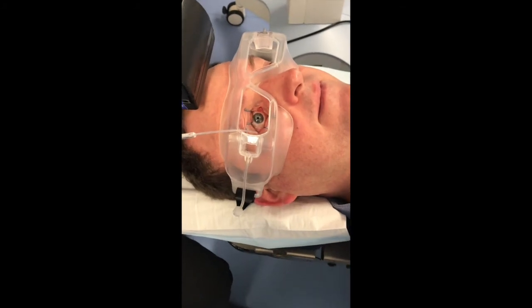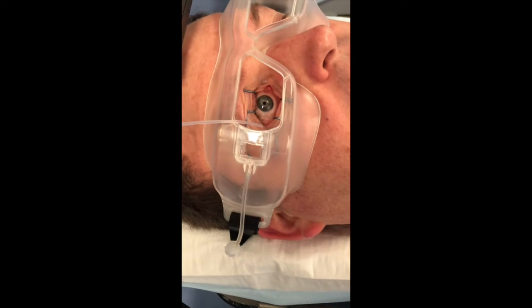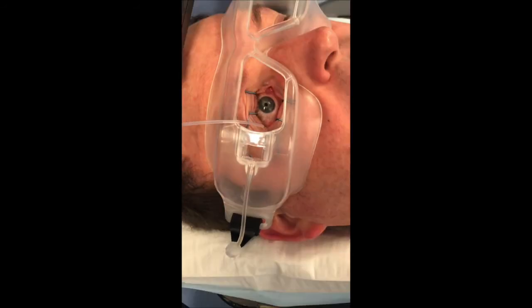Here's a video of somebody testing the oxygen percentage in the goggles on me while I'm pretending to have the procedure. It really is important to get this above 95% — it's easy to do. I've never had an issue with it, but if it isn't going above 95% very quickly, ensure there's no kinking in your oxygen tubing, or else turn up the flow on the oxygen system. We normally find we get 95% with one and a half to two liters per minute very easily.